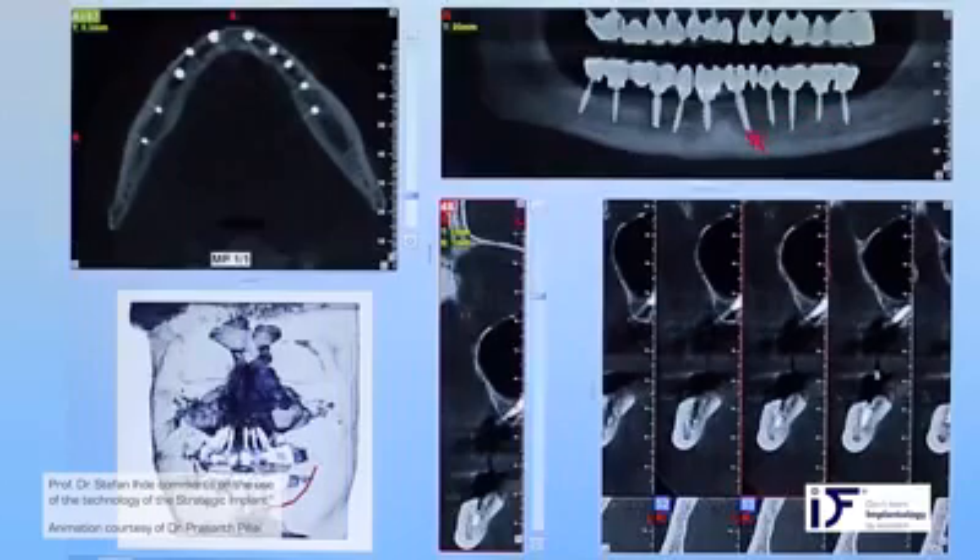Here is another compression screw. I want to draw your attention to this picture. The implants are, as I said, already a few years in. You see that integration is taking place from the implant toward the cortical — to the lingual cortical and the vestibular cortical. You also see that there is no mineralization between the implants — only black, and this is really black. There is no bone or mineralized bone there. The reason is that implants integrate and transmit forces only in the direction of the cortical; everything else makes no sense. Although these implants are very small — the diameter of this vertical shaft is only 2 mm — only the part directed toward the cortical is integrated, at a high degree of mineralization.